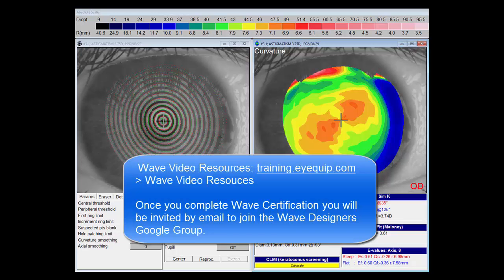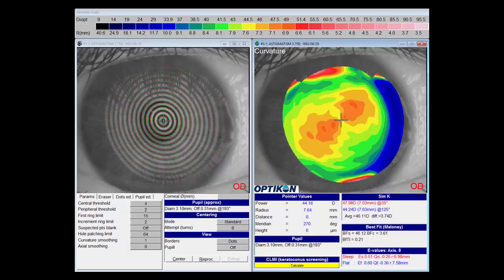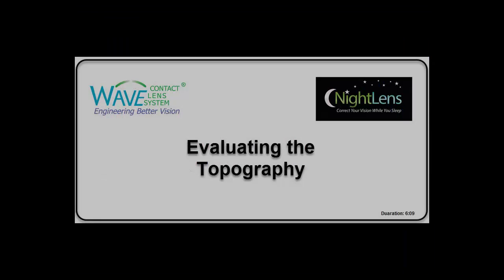I would encourage you to regularly visit the Wave video resources page and become an active participant on the Wave Google group. You'll find a wealth of knowledge and invaluable insights there. Most of the questions or the problems that you may encounter can be addressed through those resources. Now it's time to have some fun and actually design a lens.